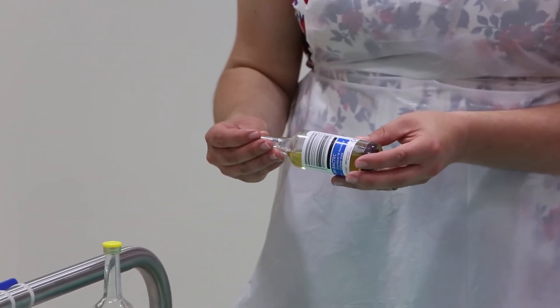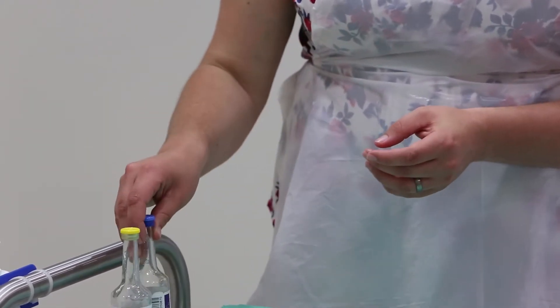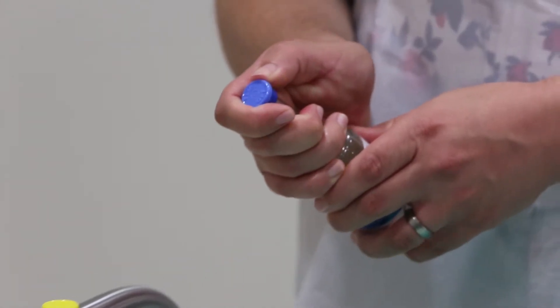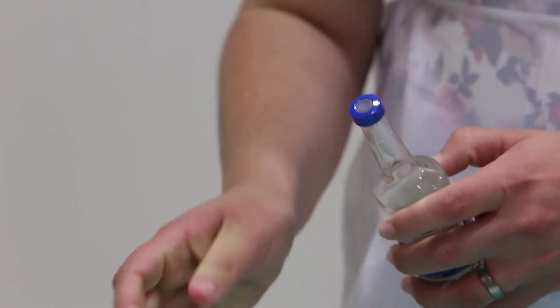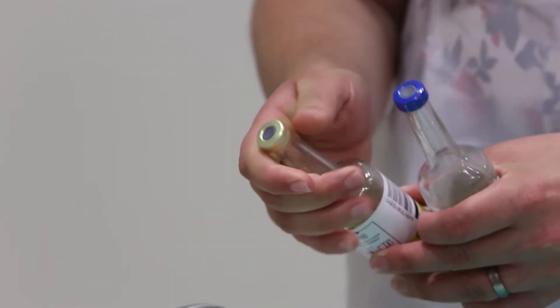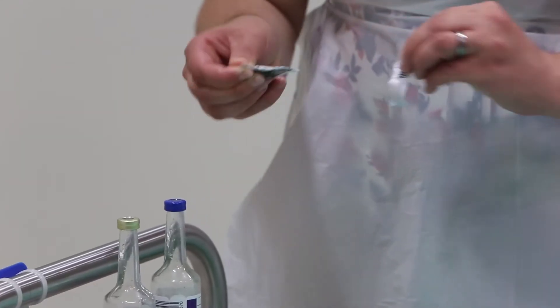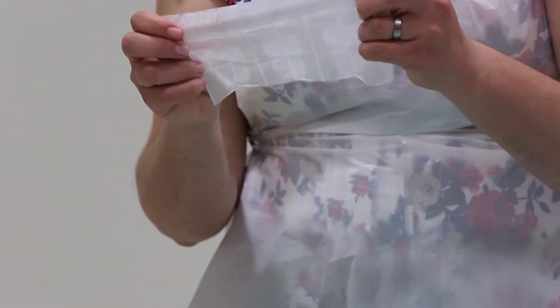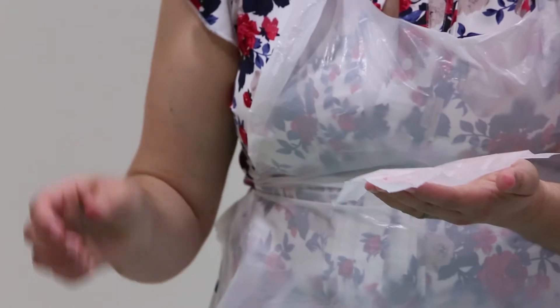Ensure the blood culture bottles are good for use by checking the bottle's expiry date. Remove the seal from the blood culture bottles in turn. Fully open the 2% chlorhexidine and alcohol wipe carefully as shown and lay it into the palm of one hand.